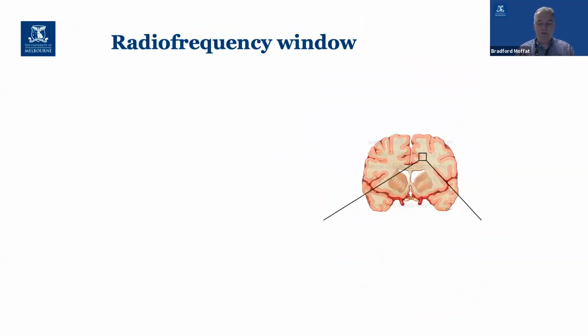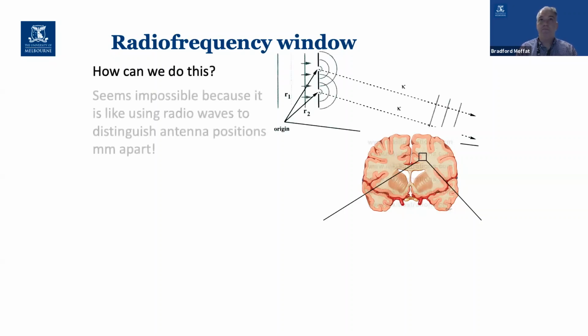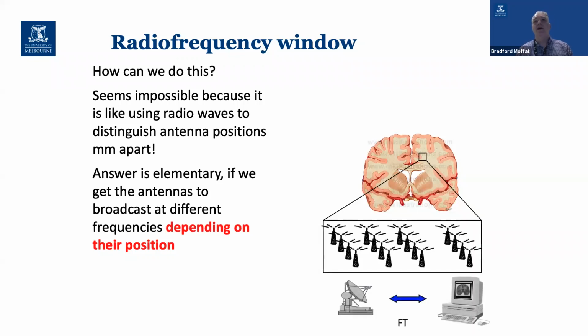And what we're really doing when we do magnetic resonance imaging, well, the original experiments are derivatives of nuclear magnetic resonance. And what we're trying to do when we put someone in an MRI scanner and seek to do some neuroscience is that we're trying to make all the different parts of the human brain operate like tiny little mobile phone towers that operate at radio frequencies. And there's some quirks of quantum mechanics that allow this phenomena to occur, but we can do it with great precision. And when we get these parts of the brain to operate like little tiny mobile phone towers, they can tell us a lot about the biology that's going on around them in terms of molecular dynamics and the chemical environment that they're in.